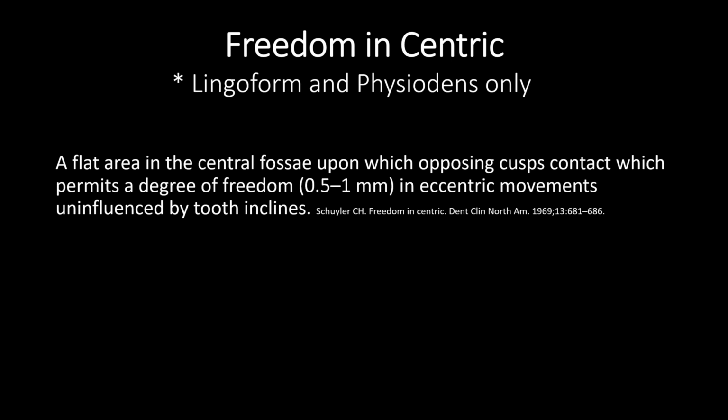They're one of the only denture teeth on the planet that has this capability. We forgot about this. So 20, 30, 10 functional and 0-degree teeth do not have freedom in Centric. They are locked together. A little sample that we can do on our own is just holding our teeth together in Centric. And I want you to gently wiggle your teeth together. Don't go eccentric. Don't move your jaw out and start going up the cuspal rise of the teeth. You should be able to wiggle them strictly in Centric.